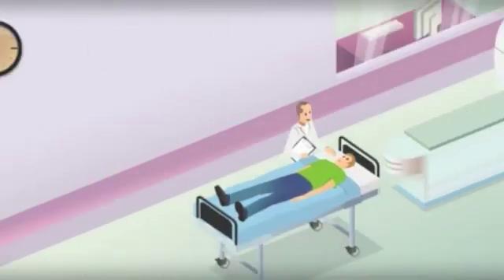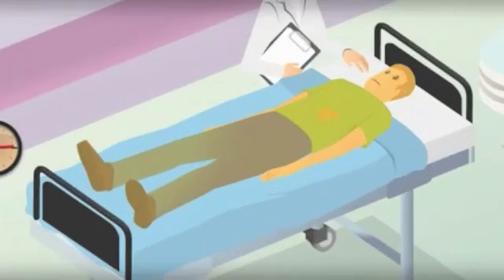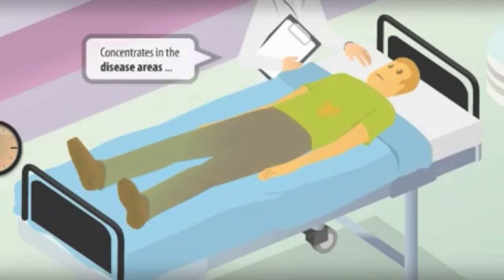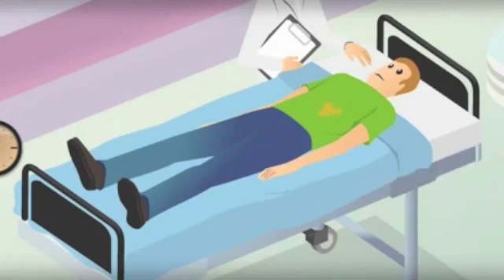In the nuclear medicine department, a radiopharmaceutical is injected to the patient. Radiopharmaceutical distributes itself in the whole body and concentrates in the disease areas. It is taken up by the lesion, and any residual is naturally eliminated.